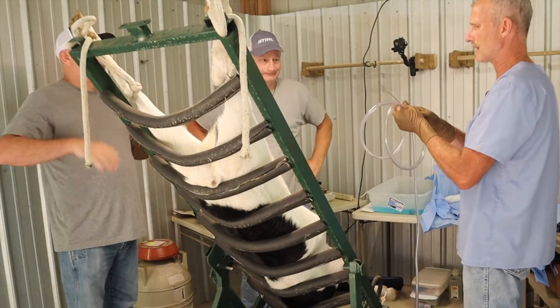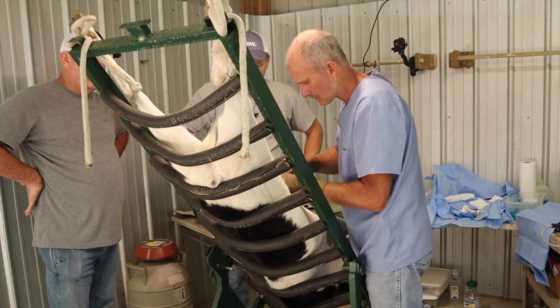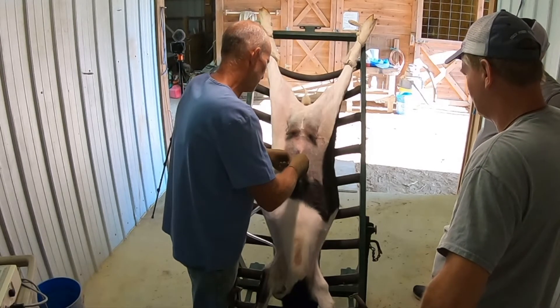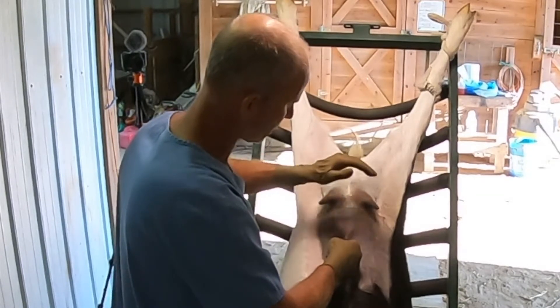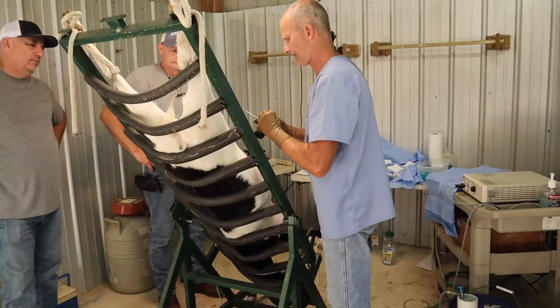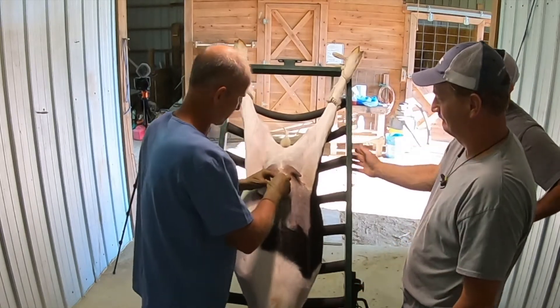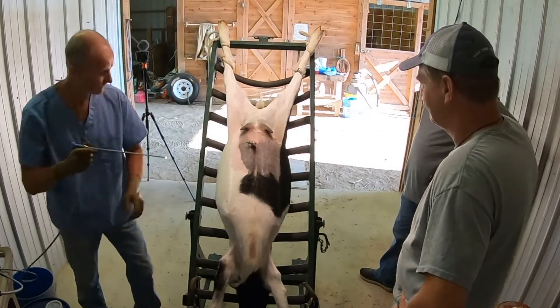We'll use CO2 so that we can expand and push things away from where we're working. We'll insert this Veress needle — here's the abdomen. Once we get into the abdomen, we can insufflate. It's blunt, and then we can open it up. We like to get some distension there so we can see what's going on. Next we put a trocar in — pop through. Time to have our look and see what kind of shape things are in.